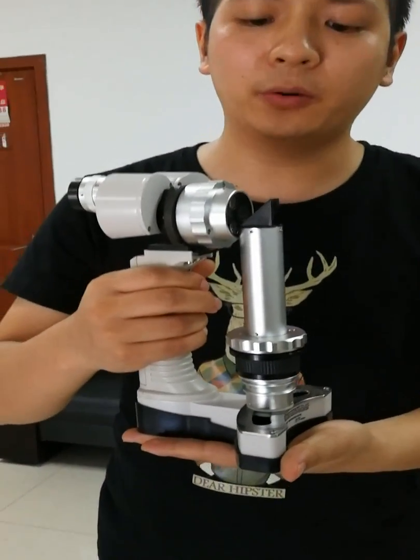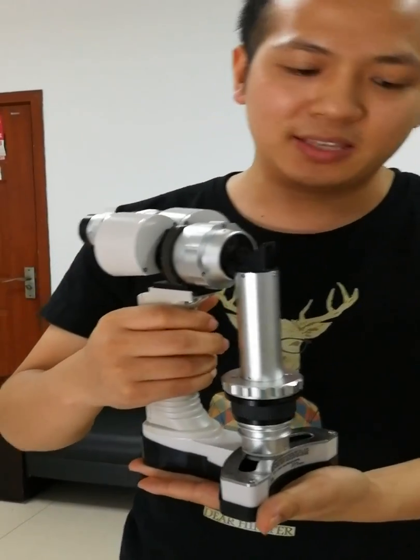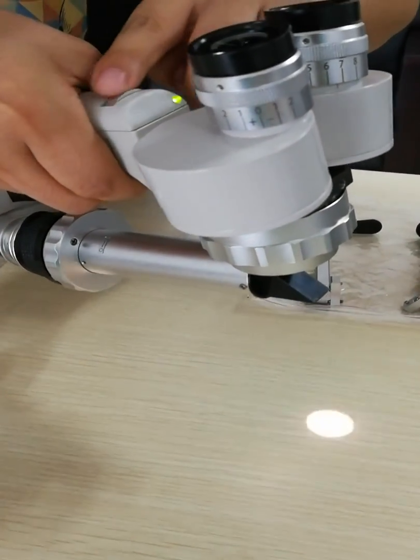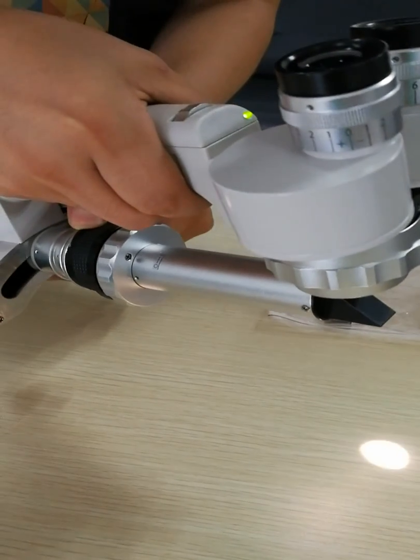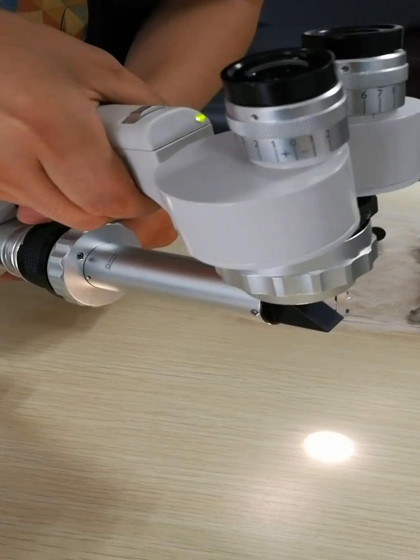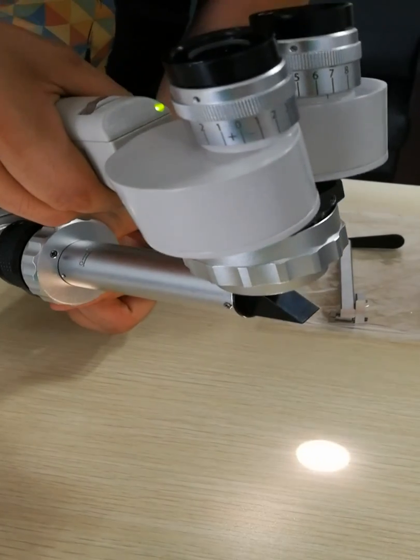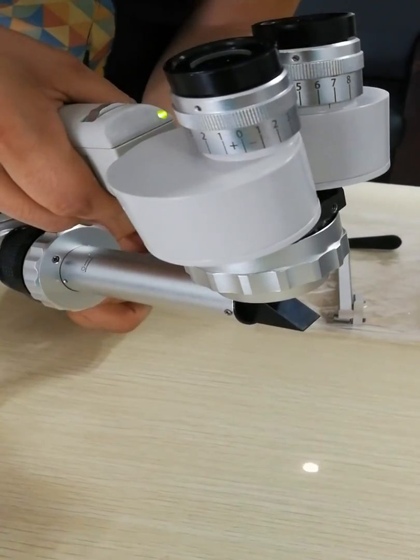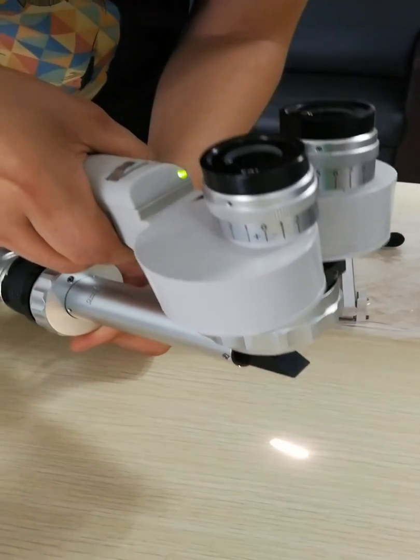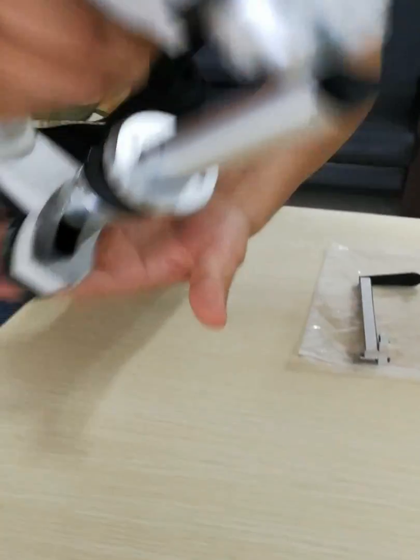This is the portable slit lamp. The function is the same as the table slit lamp. There is a brightness change, a filter adjustment — you can see different filters, same as the table slit lamp — and a spot size change. There is also a slit, as you can see, and it's very sharp and clear.